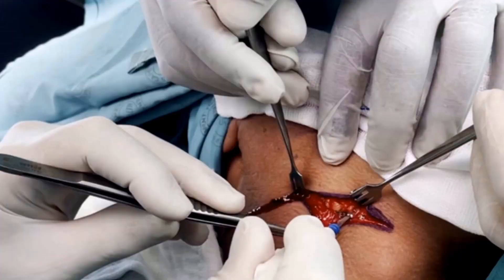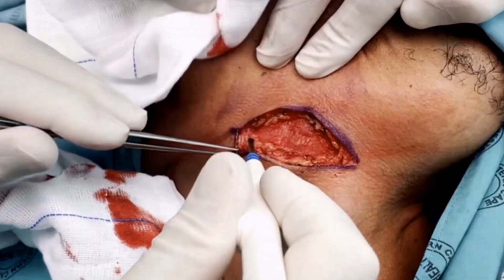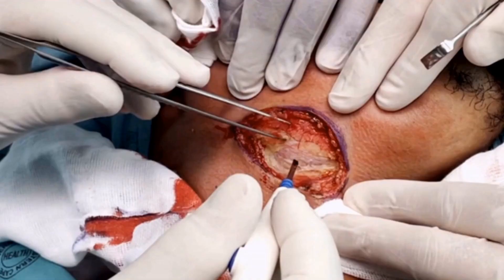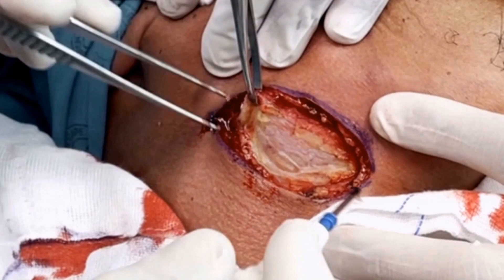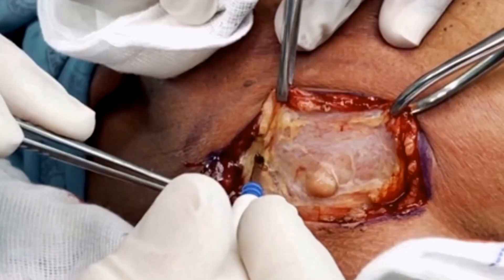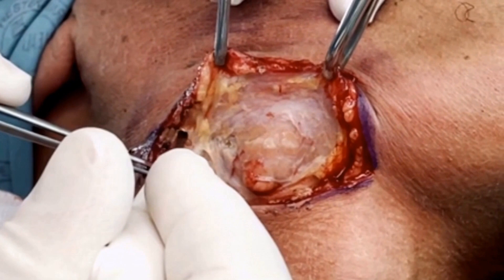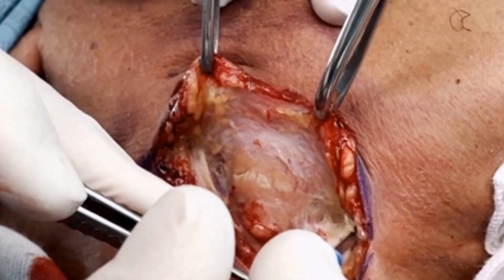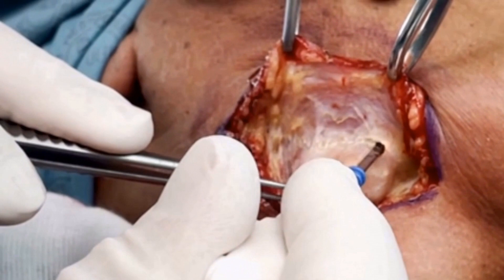Incise the skin then subcutaneous fascia to expose the underlying fat, which is then divided using electrocautery to expose the platysma muscle. Transect the platysma muscle and expose the underlying fat, which is then divided to expose the submandibular salivary gland, remaining inferiorly to protect the marginal mandibular nerve. Cut through the fascia surrounding the gland and apply upward traction on the capsule of the gland. Dissect superiorly staying in the subcapsular plane to protect the marginal mandibular nerve, keeping an eye on the corner of the mouth during this dissection to detect any stimulation of the marginal mandibular nerve.